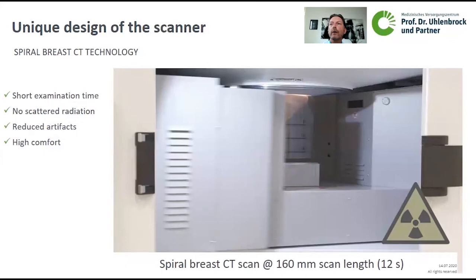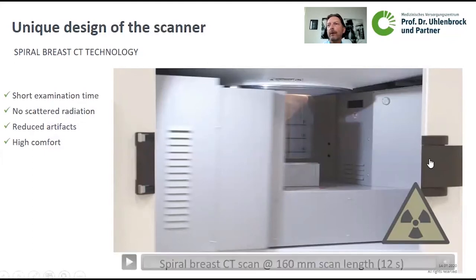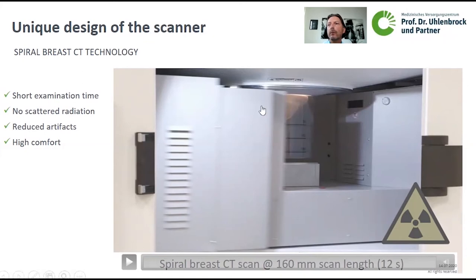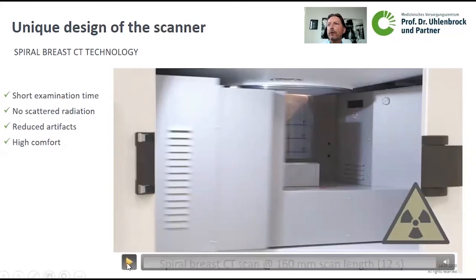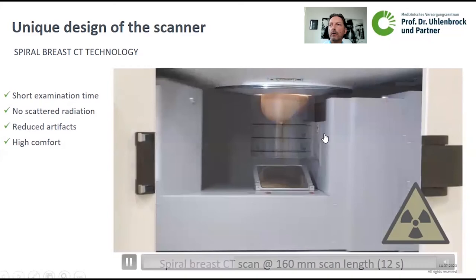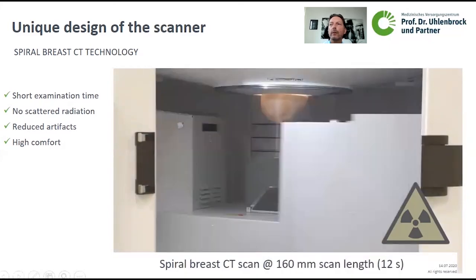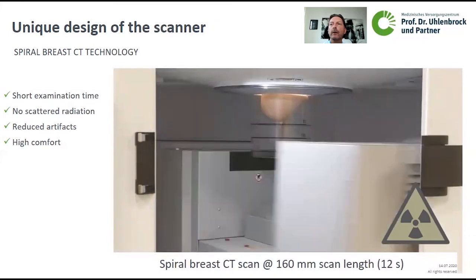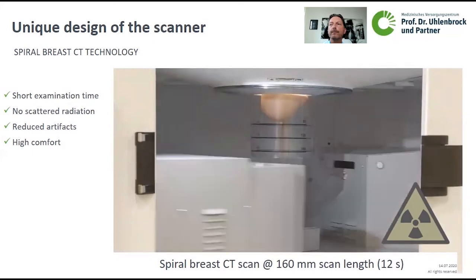To illustrate this procedure, here is a short video. You see the unit starting imaging right under the chest wall of the patient. The whole examination per breast takes about 12 seconds — a very short examination time. Due to the setup, we have no scattered radiation and reduced artifacts, with very high patient comfort. You see the tube and detector rotating around the breast while simultaneously moving down along the longitudinal axis of the breast toward the nipple. After 12 seconds, the scanning procedure is complete.